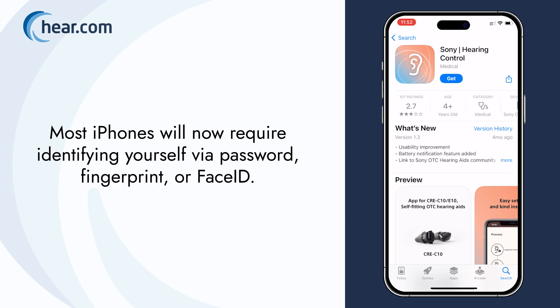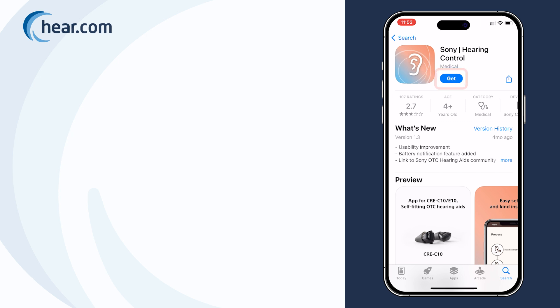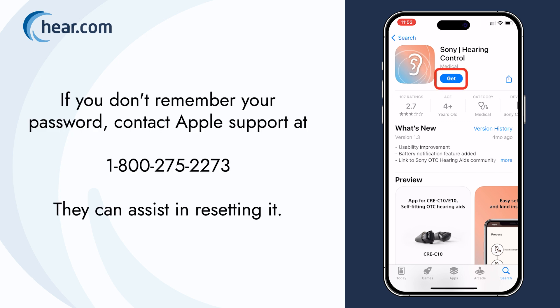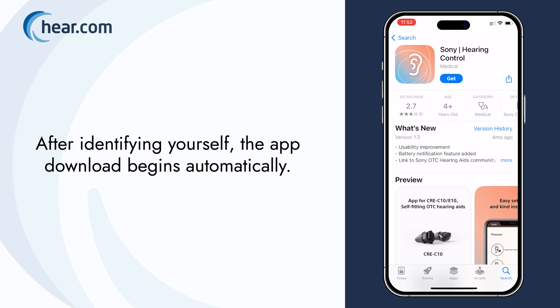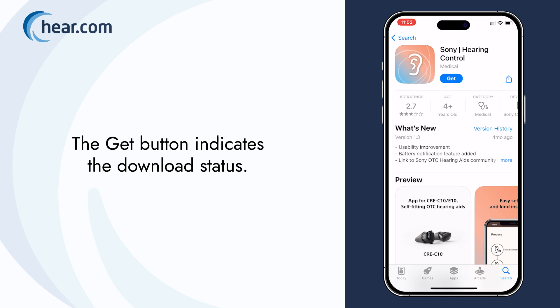Most iPhones will now require identifying yourself via password, fingerprint, or Face ID. If you don't remember your password, contact Apple Support at 1-800-275-2273. They can assist in resetting it. After identifying yourself, the app download begins automatically. The Get button indicates the download status.